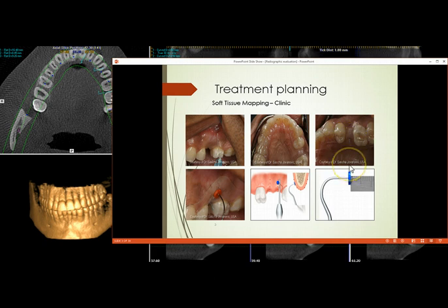So again, a little bit more work, but if you understand, this is a nice technique to be able to find the width. We use the height with a PA, and then you do a clinical exam and make a nice stent that's hugging the tissue, measure the distance from this dot to this dot as your whole number, and then subtract it when you place it in. So you'll know exactly what the tissue height is on each side.